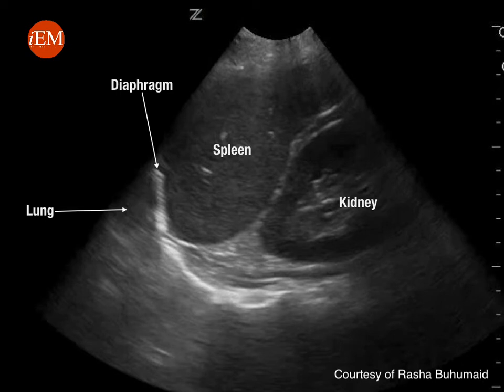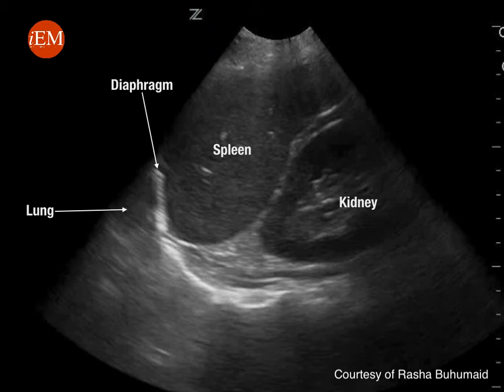The same technique and image interpretation applies here. The normally aerated lung on the left side will appear very similar to the spleen, due to the mirror image artifact previously discussed. Having this view rules out pleural effusion on the left side.